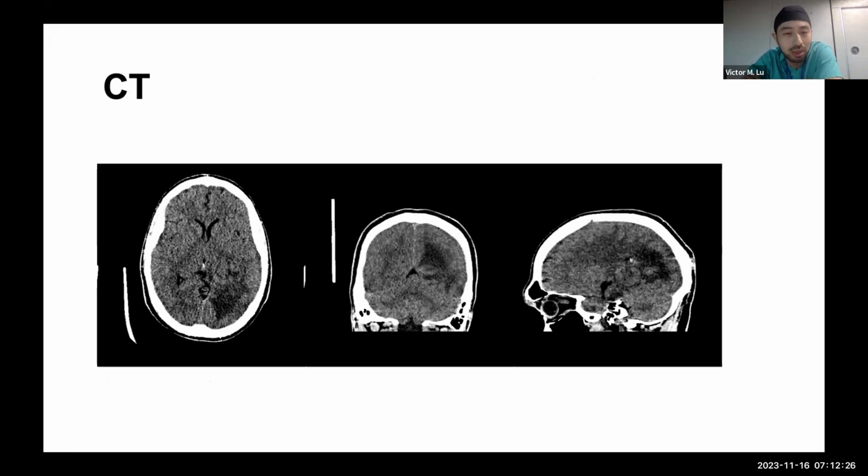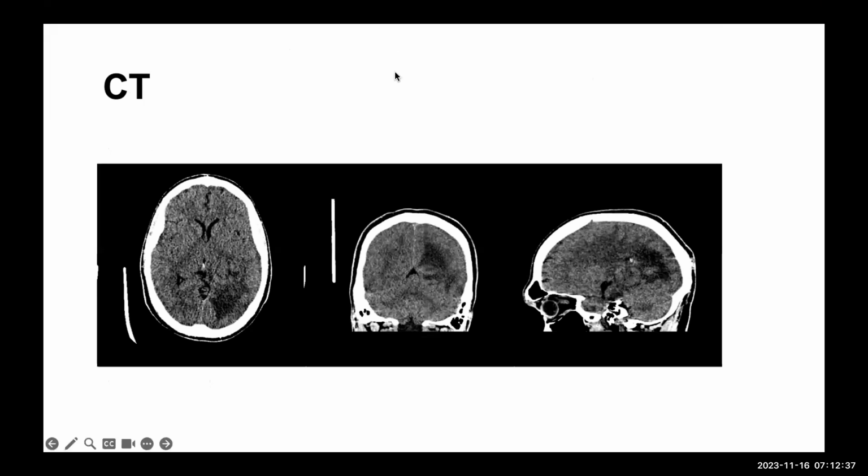Why don't you tell me what these sequences are and if you can see anything? Sure. So we have, left to right, soft tissue window CT of axial, coronal, and sagittal windows. On the left, sort of temporo-occipital, you have a lot of hypodensity, likely some vasogenic edema. You may have a brain tumor if he's having dysarthria and these other symptoms, but you can't really say for sure on a CT, so would need an MRI with and without.